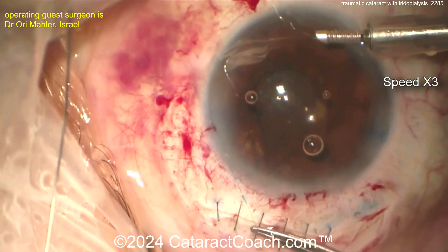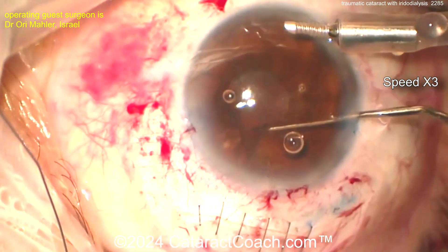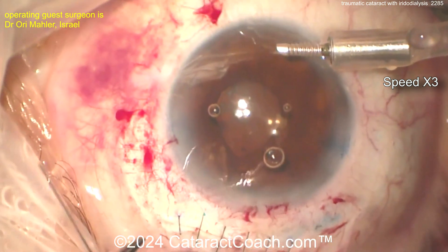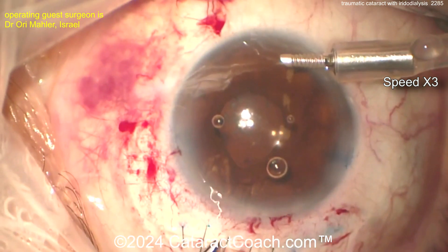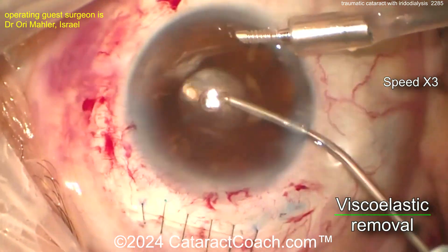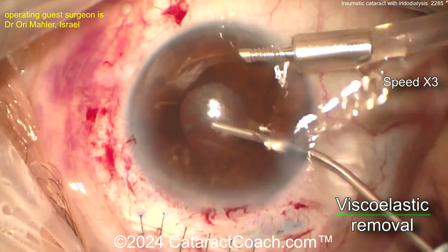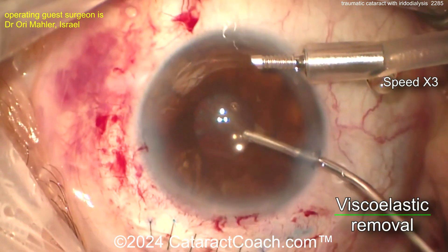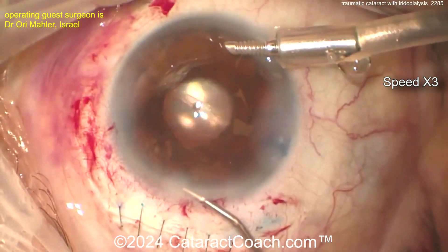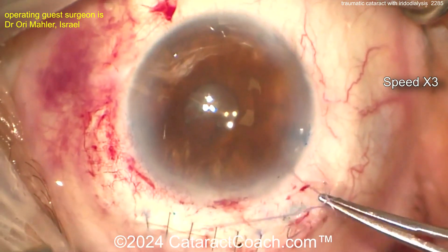Getting that there, tying that up. Maybe do a couple on each side and see if you can get that iris resuspended. It may also be a little slicker to get that tiny 10-0 polypropylene hidden in a scleral groove so it's not just sitting under the conjunctiva. Look at that — the pupil's gone back to round now. Looks pretty good, I like it. Seal up the incisions, call it a day.